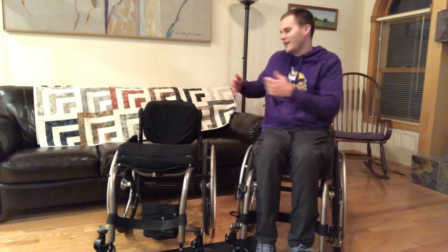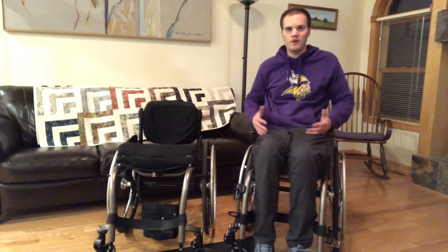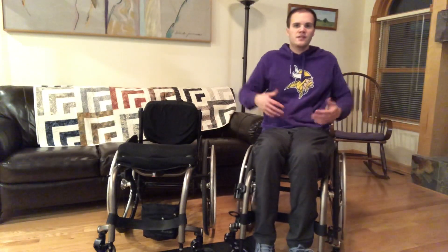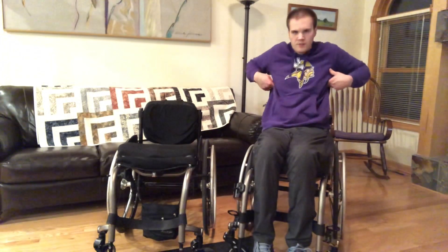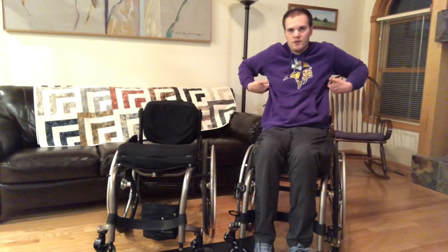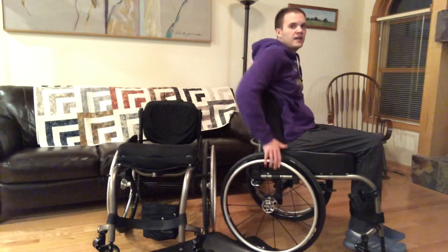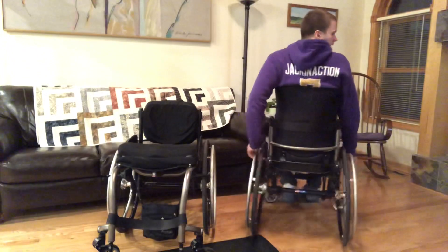Here's my brand new wheelchair and here is my older chair. Right now I'm just going to transfer into this chair so you can see the difference in my posture. So right now I am being supported all the way up to here with my backrest. You can see that it's that high and that's what the back looks like.